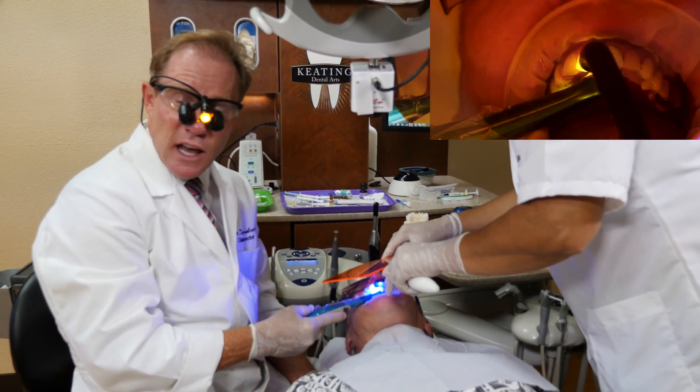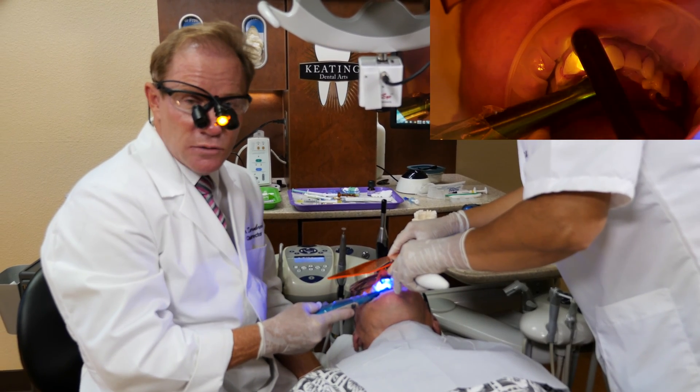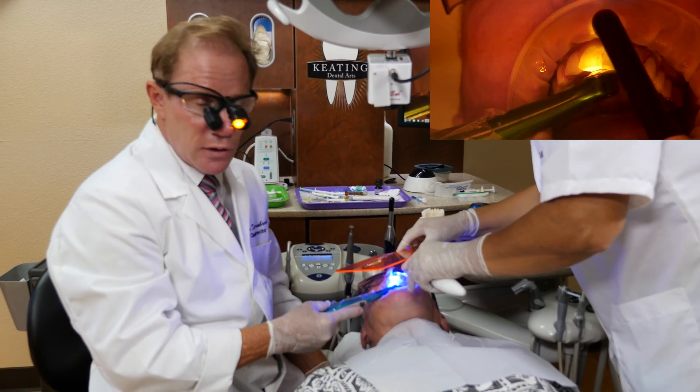This new KDZ aesthetic is one of the zirconium materials that is really translucent, so we'll be able to cure right through it.